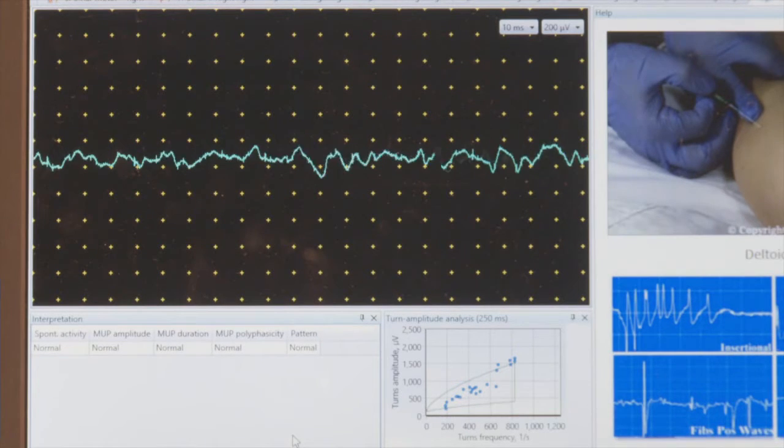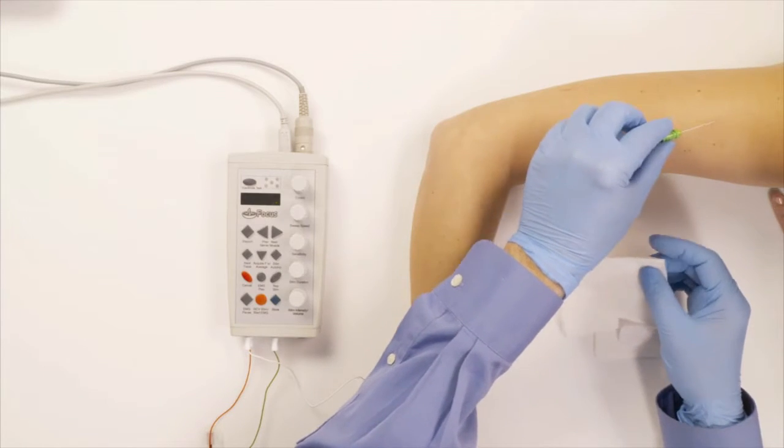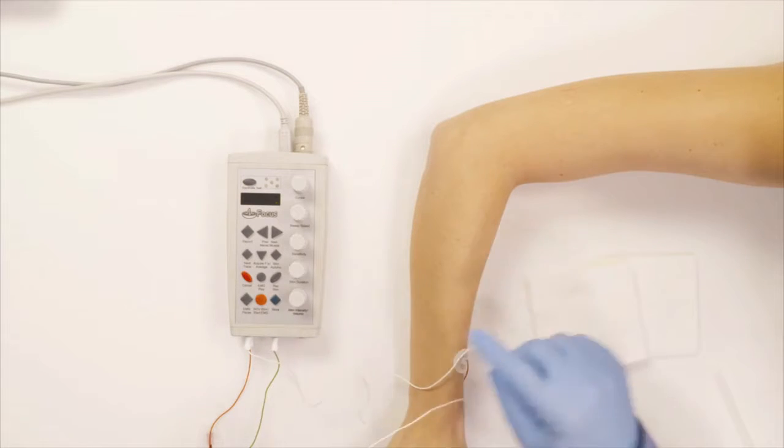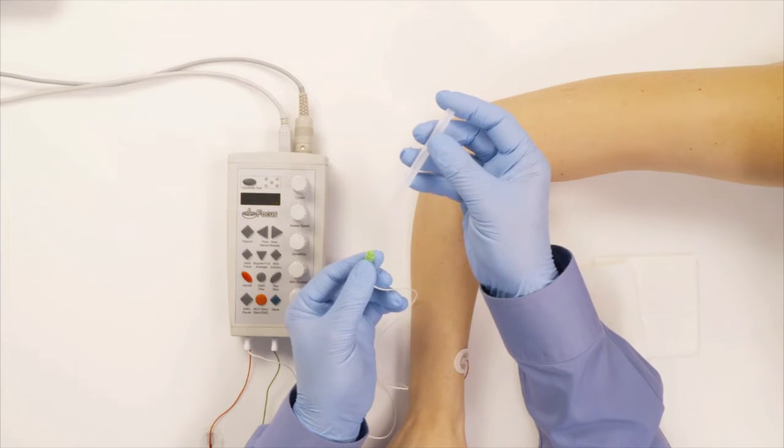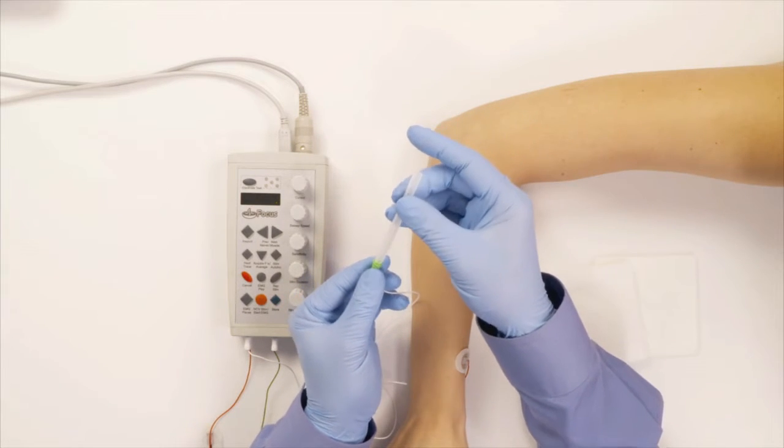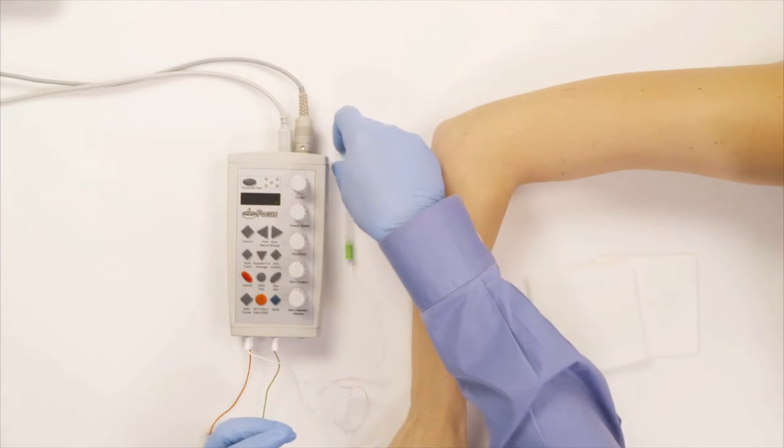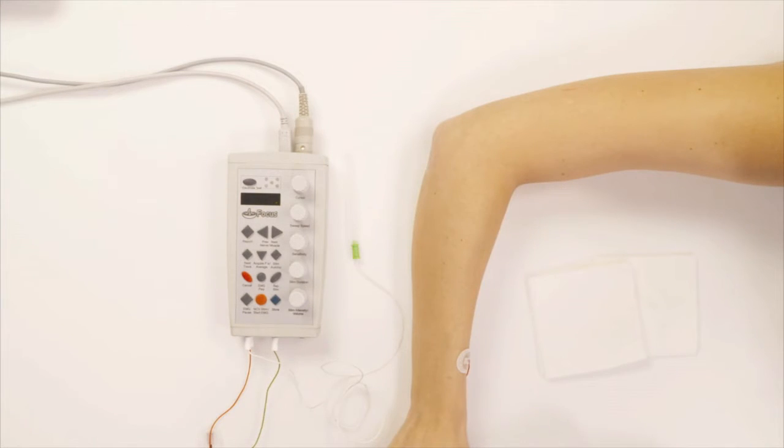And that's the deltoid and I'm gonna take the needle out and make sure she's not bleeding. And as soon as I take the needle out I'm gonna sheath it again, make sure you don't stick yourself. Here we go and now I'm done with the upper extremity.